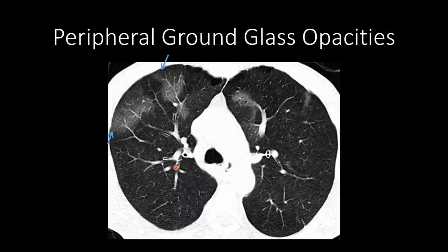This is another patient under investigation. We can see ground glass opacities in the periphery of the lung which are starting to become confluent. You could imagine that maybe there were two or three nodules here that have increased in size, creating a confluent peripheral ground glass opacity.